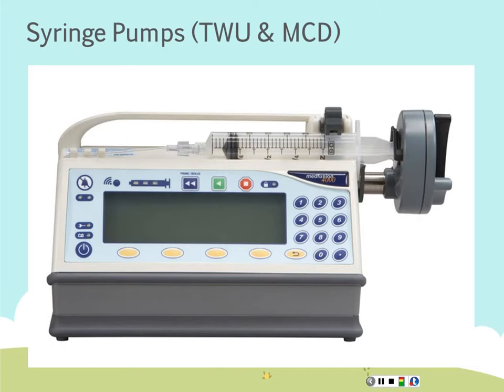Those are the ones that you're going to work with in the lab at TWU, and currently they're the ones that Medical City Children's has. These are Medfusion pumps. There are different brands of syringes, but it has the syringe in it right here, and it's going to lock on to the body of the syringe. And then you'll have the flange here, and then you'll have the little tip of the flange, and this will capture this. So the body of the syringe is being held secure, and this piece right here is the driving force pushing, just like you would push it at a controlled rate through the tubing.